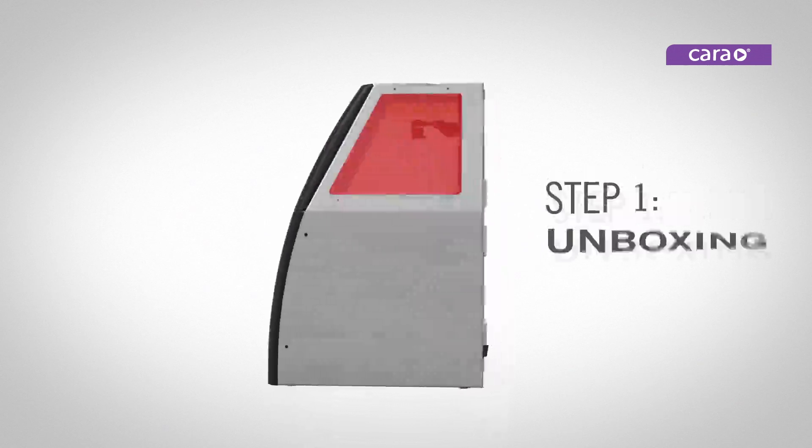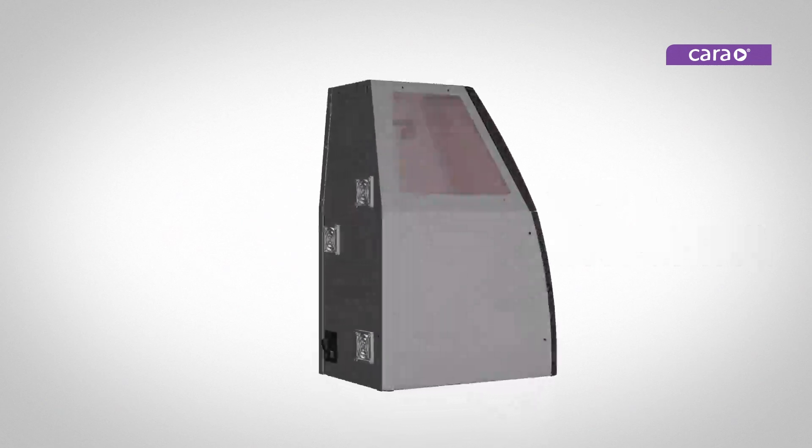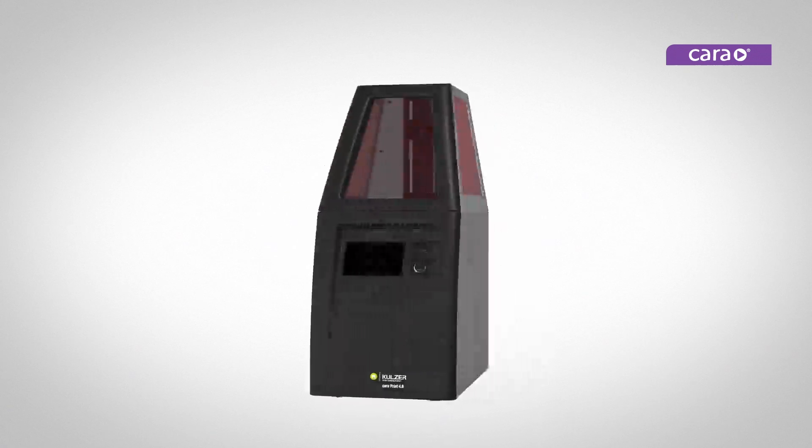After opening the box, take out the accessories and packaging. Carefully lift out CaraPrint 4.0 and place it on a secure, level workbench. Check that you have removed all the accessories.